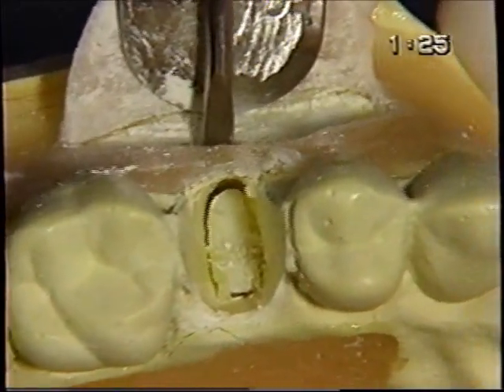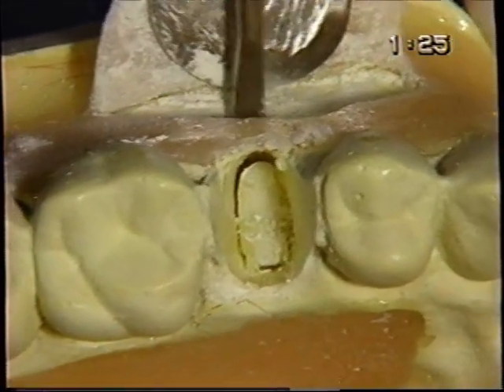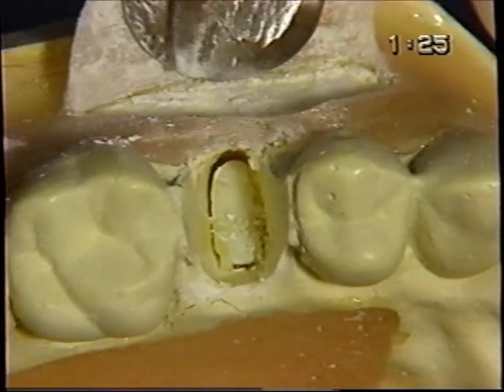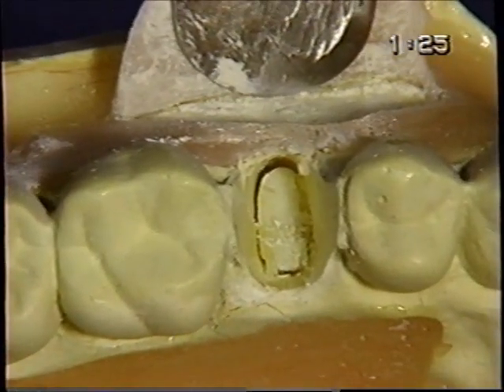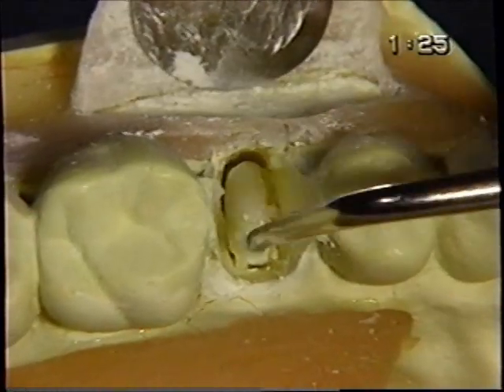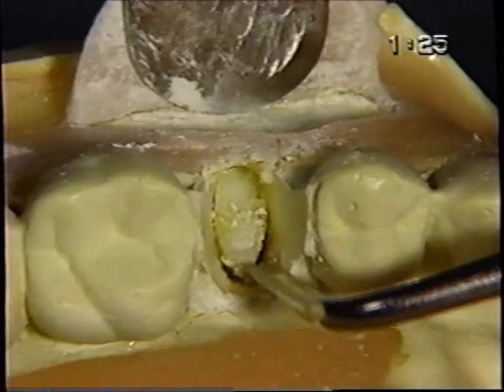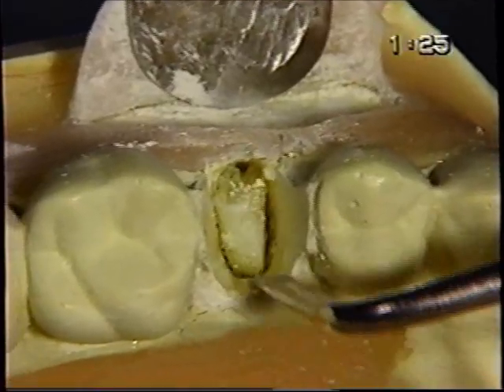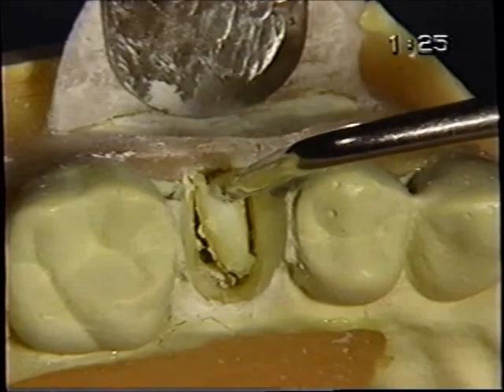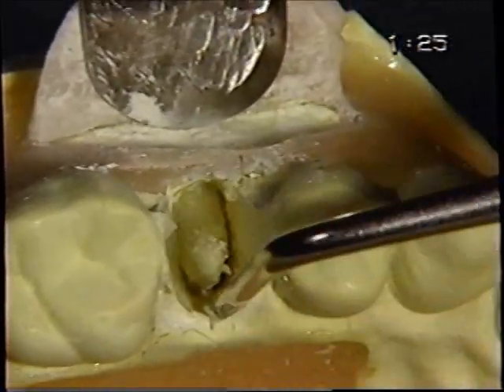So after having done this, I've felt the end of the root, I've loosened it. A lot of times it'll pop right out. In fact, I've had it even pop out so quickly that it hits the patient on the tongue and they hand it to me. In this case, it's dislodged, but it's not just coming on its own. But because it is loosened, we can reach in here now with the root tip pick, whereas we couldn't do this before, and we can get it the rest of the way out.